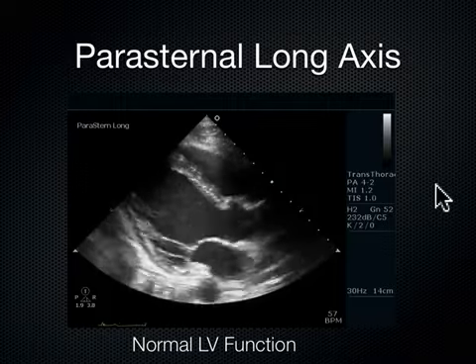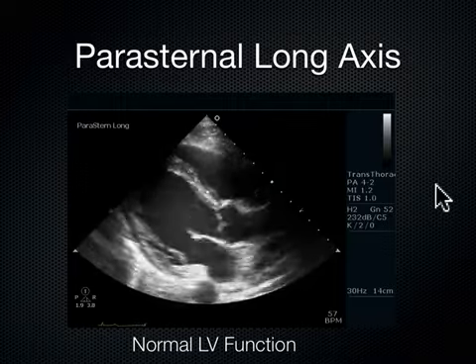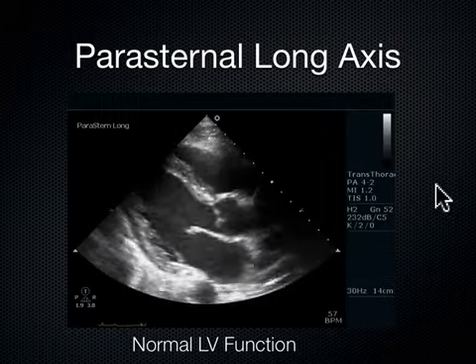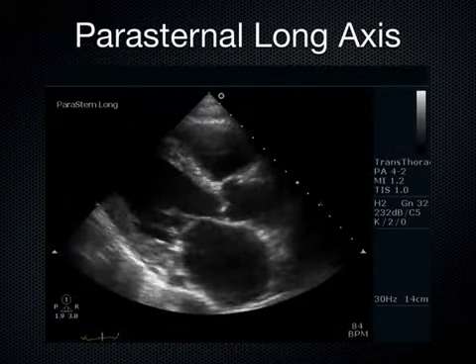And that's what I want you guys to remember. Quantitatively, I think the cardiac output stuff we're about to do is very useful. Ejection fractions, I don't know. I just like to look at these hearts and decide what I'm going to do next. How about this one here?